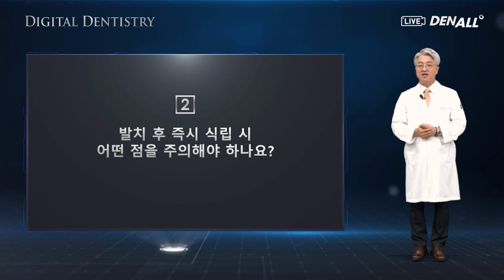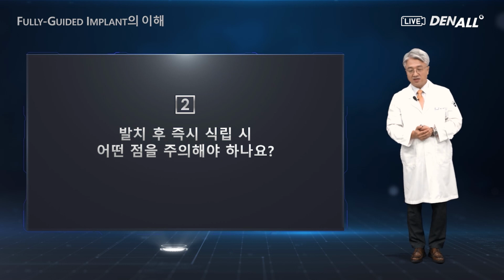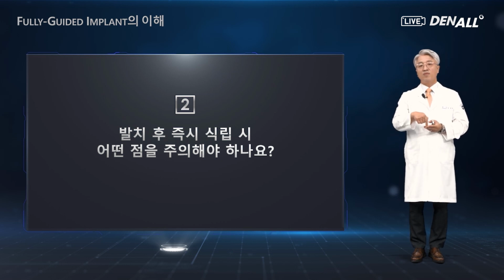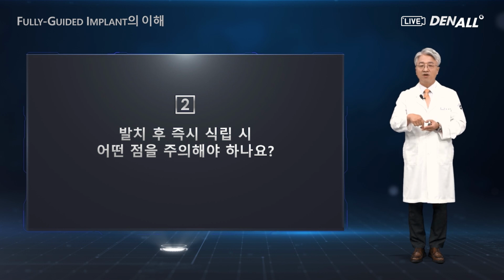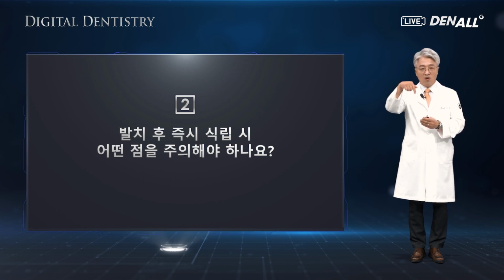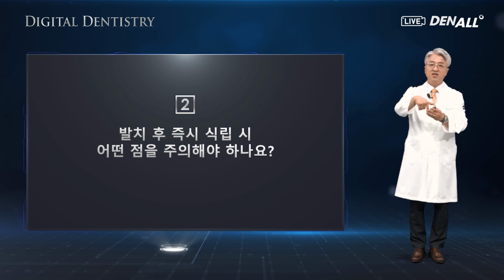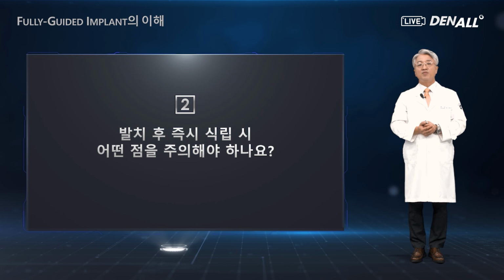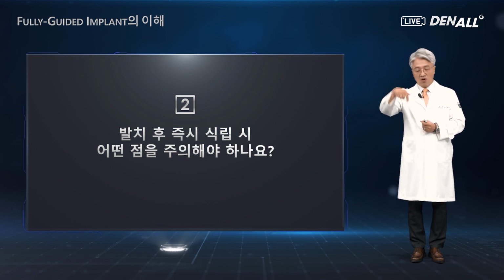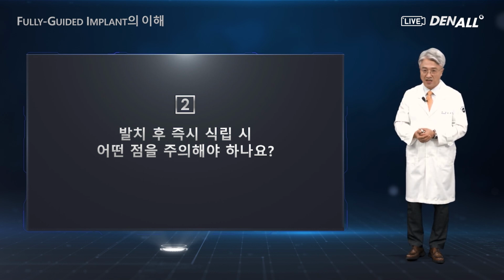Right after the extraction, during immediate placement, if I feel the drill is slipping rather much, then I switch from low speed to high speed with irrigation. So I use the high-speed drilling. One more thing, when we expand the drill hole, I try to expand the hole as wide as the fixture so that when a fixture is placed, it cannot slip in the other direction, even though the initial stability may become low.